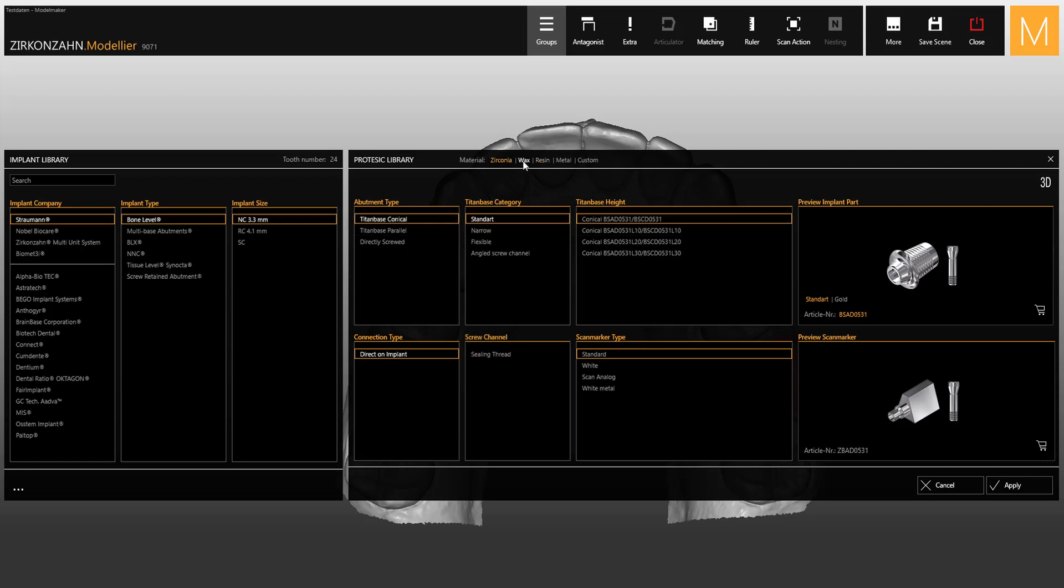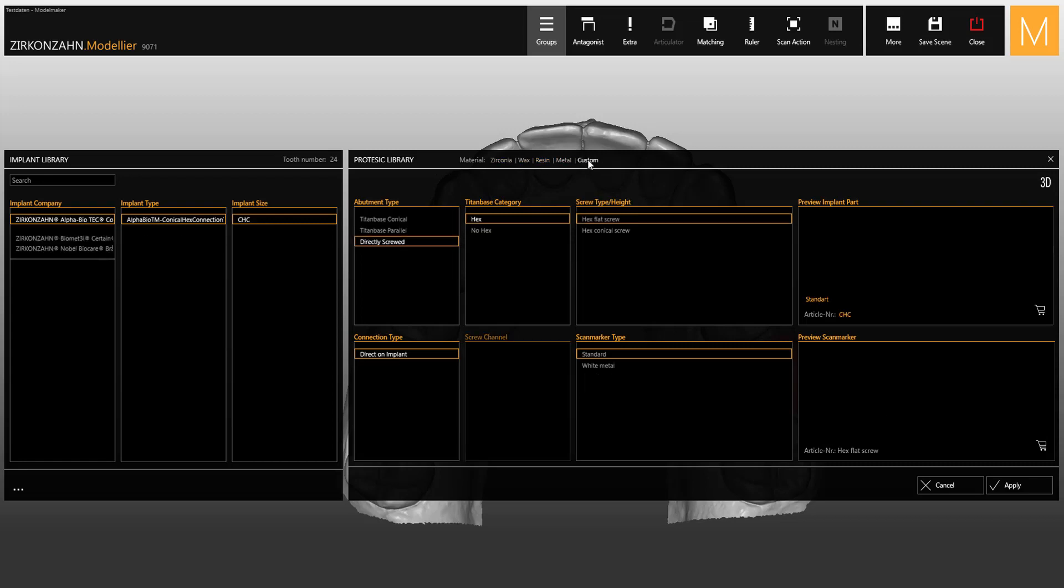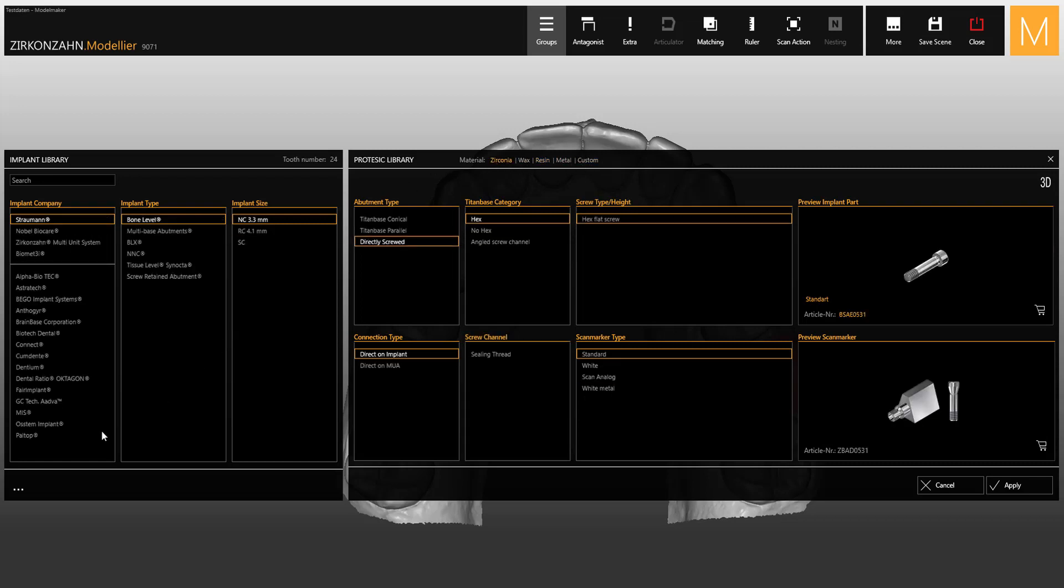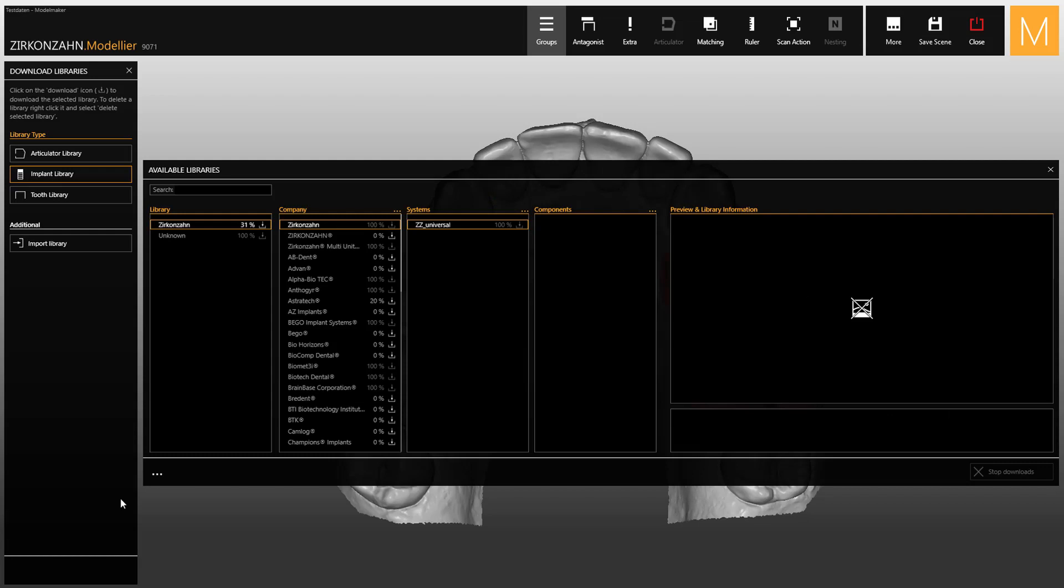First of all, select the required material. Then, in order to easily expand your library, click on the three points at the bottom left corner and choose Download Additional Implants. Now select the desired implant company. You don't have to download the whole system, but only what you specifically need.